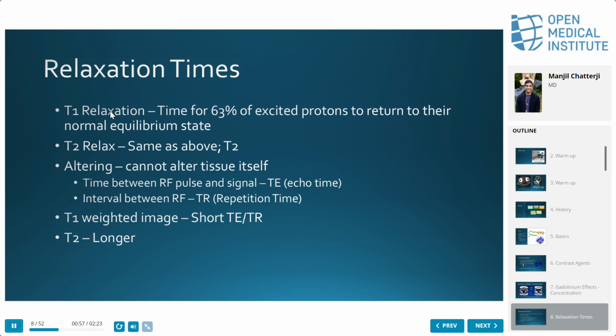So again, put a patient in a magnet, and all of the precession, hopefully a lot of it, will align with that of the magnet, right? It's like a dipole magnet. If you've ever played as a kid with those magnets, when you put them together, they stick, maybe they repel. And if you put a patient in the magnet, we have our own magnetism, just like that. So I go in the magnet, my body, all the protons start aligning with the magnet, right? And in doing so, then I can measure a difference. Because now, once I put the patient in the magnet, I can do other maneuvers, which I'm going to talk about, to then determine how those protons, after being put in the magnet, can relax and change and come back to their original state. T2 relaxation is the same, but for T2.